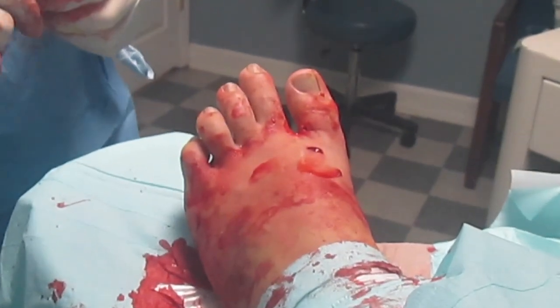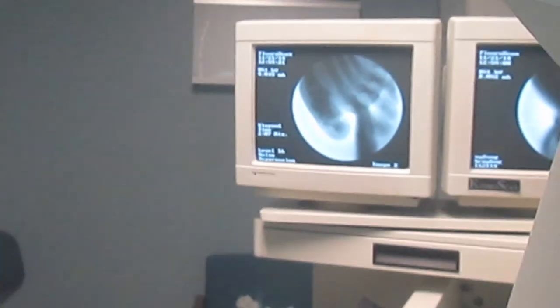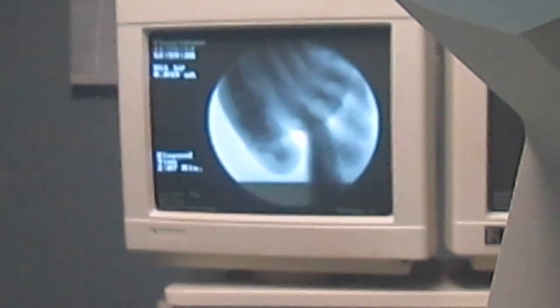So now we have a lot of the correction already. Take a view real quick at our C-arm fluoroscopy here. You see we got a good closure down. So we don't want to close it too much more than that. That's going to be pretty good.